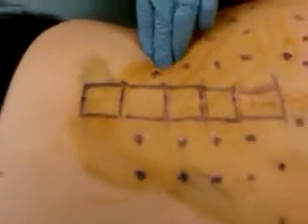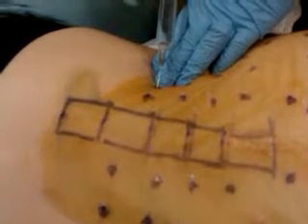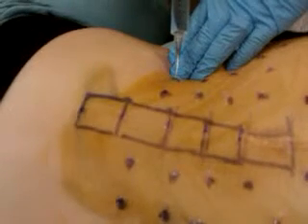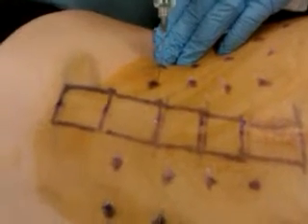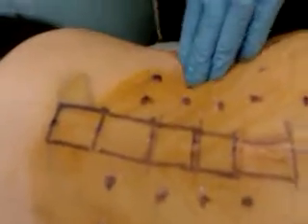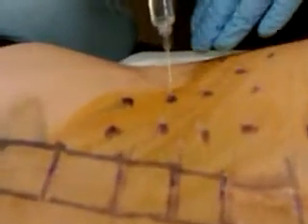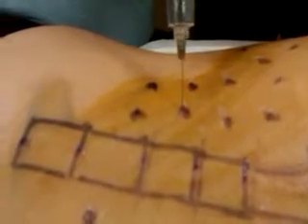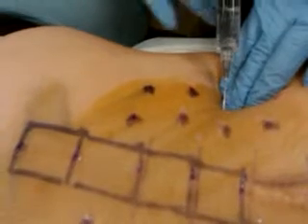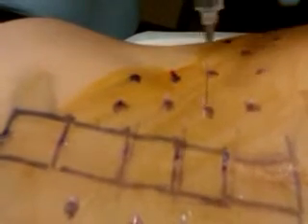This is a 4-inch needle. Alright, here's the big one. So you palpate the spinous process and you go straight down. That's a lot of jerk — that's the first time I actually inject this level. We're going to inject the facet — she might jump. This is not the first time I inject that level. This needle goes about three inches deep. I usually use a four-inch needle. See, that facet was really painful. That's it — see, for the transverse process.